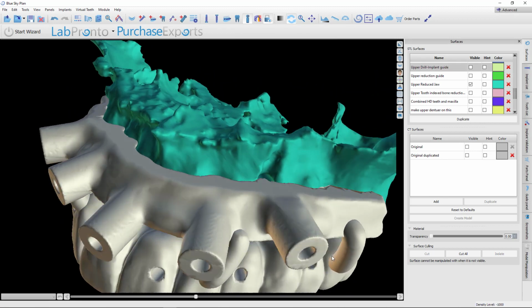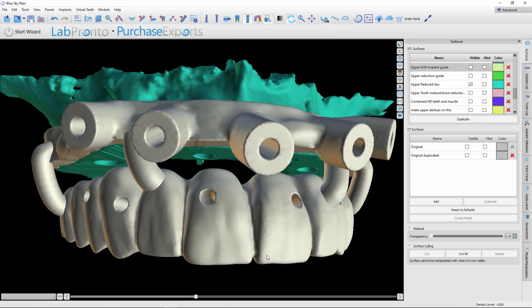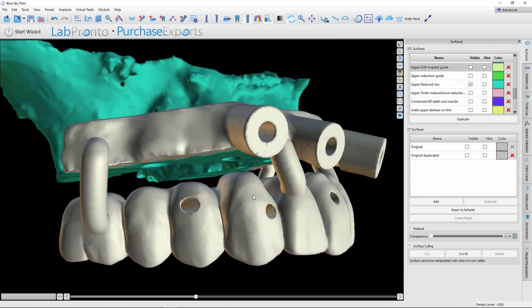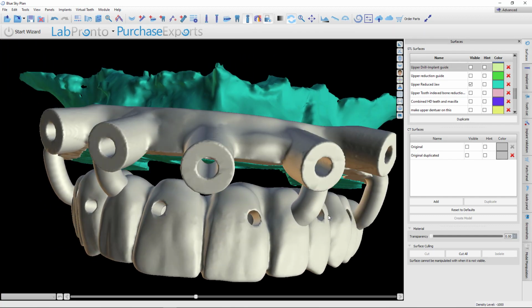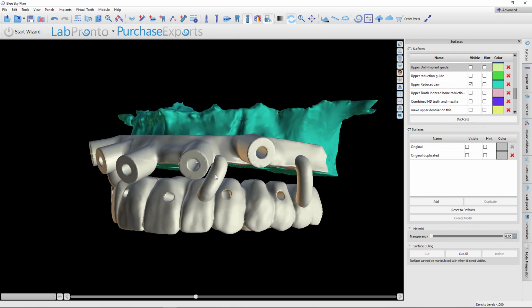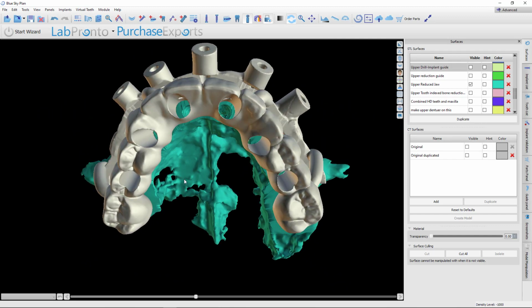This is the immediate load prosthetic. And due to the space, by the time that you gave yourself 3 millimeters of space for the gingiva, there really was not adequate room to do a traditional hybrid restoration here. We were kind of on the low end of the space that's required. So what we've done instead is an FP1.